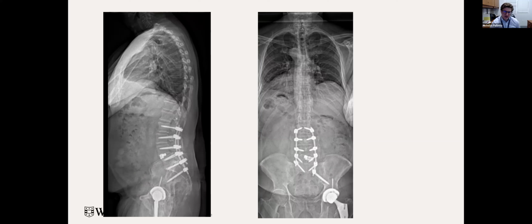Yeah, I think that varies. To your first question, I believe this was a Pro-axis table, if I remember correctly, to help both with placement of the interbody cage and doing the transforaminal interbody work, but then also closing the osteotomies and being able to extend the bed. So to that answer, yes, but I also typically do that for sagittal plane cases.